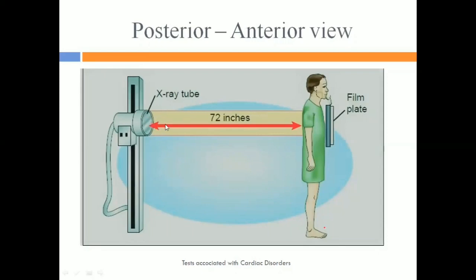So generally when these photons pass through the person's body, some X-rays will pass through the body, some will be absorbed by the body, meaning by the bones or the tissues, and some will reflect back, right? Based upon this absorption, passing through the object and reflecting back from the object, we get a chest X-ray, right?